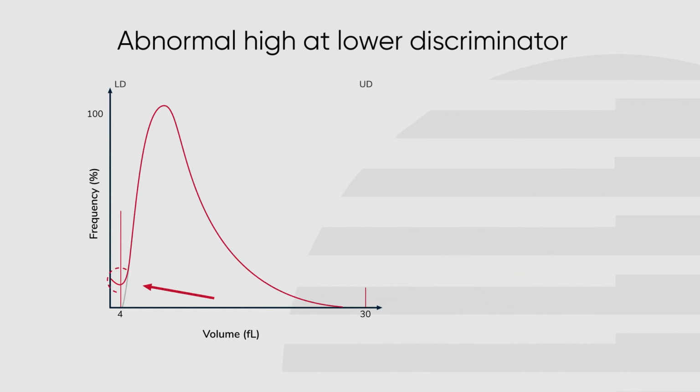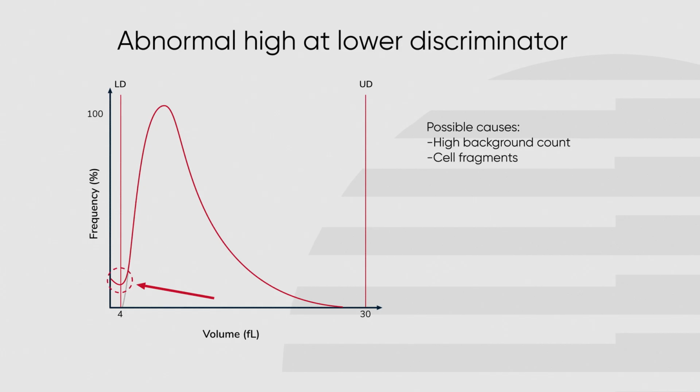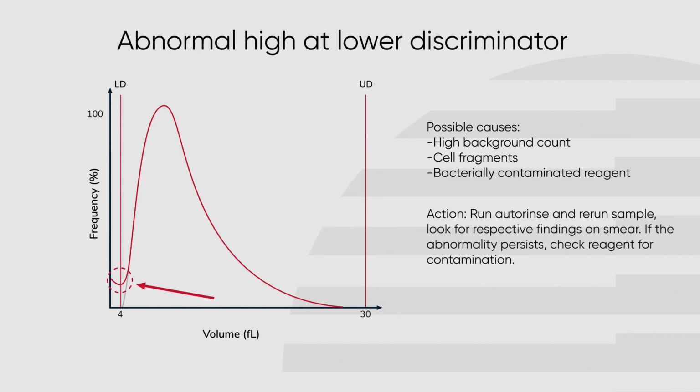An abnormal high at the low discriminator could have several causes, such as a high background count, cell fragments, or bacterially contaminated reagents. If this occurs, check the background, and if needed, run autorinse and look for findings of cell fragments in smear. If the abnormality persists, check reagent for contamination.